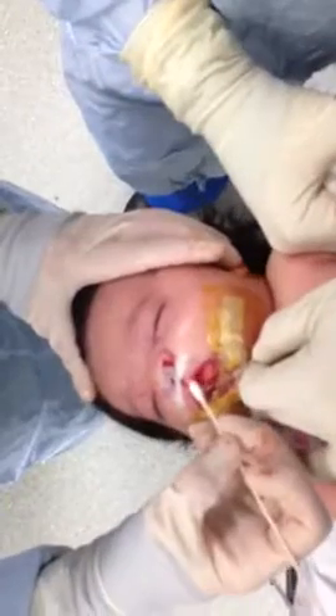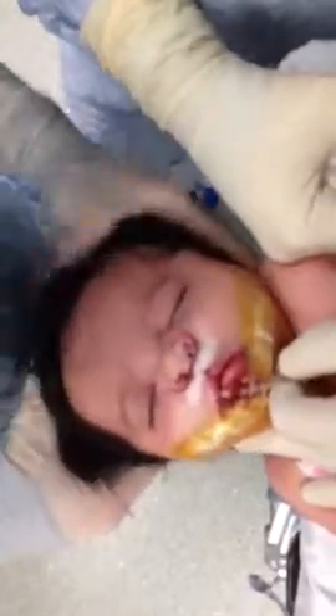You can place a teeny little bit of the ointment on the lip, but don't get any ointment on the tapes because they will come off.